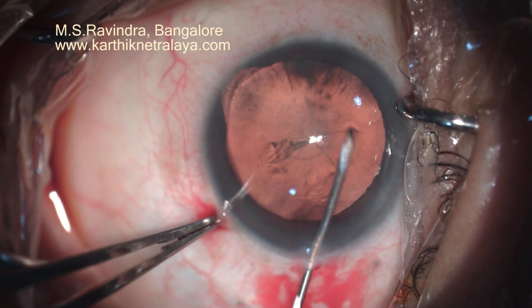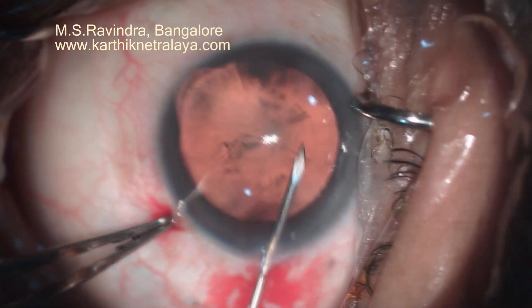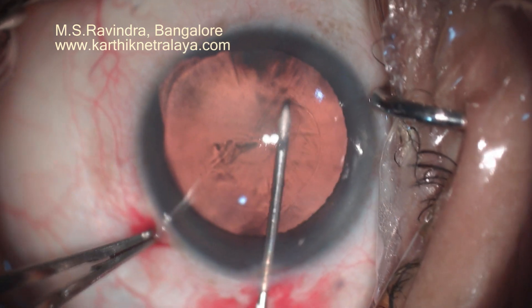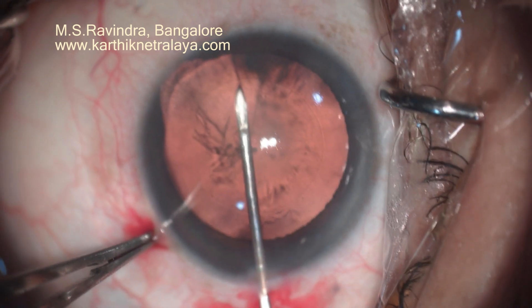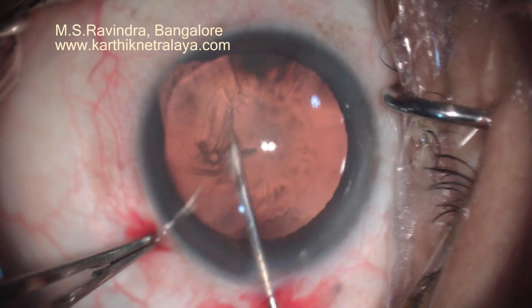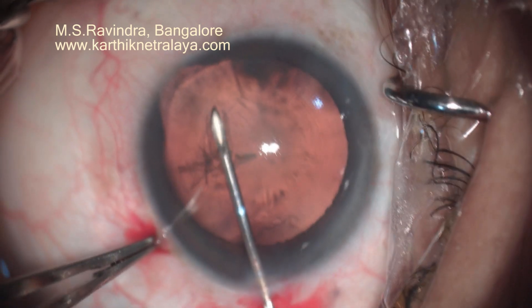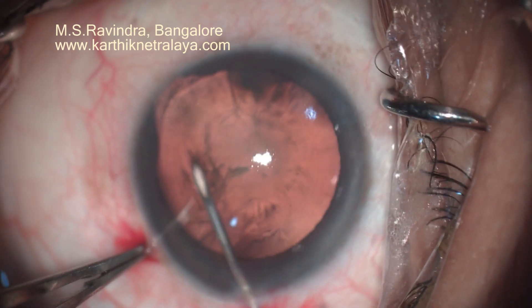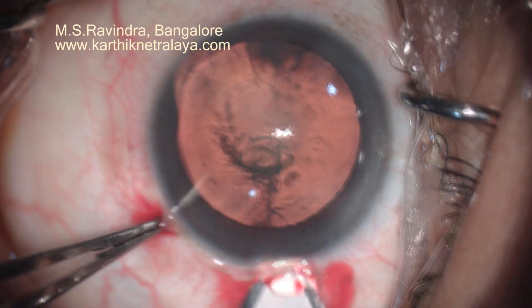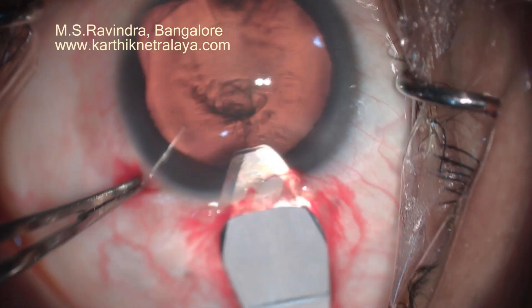The cystitome starts from an area one clock hour beyond the coloboma, as the coloboma area would often be difficult to manage — so that will be the fag end of the cystitome creation. It is a good capsulotomy without any untoward effects.